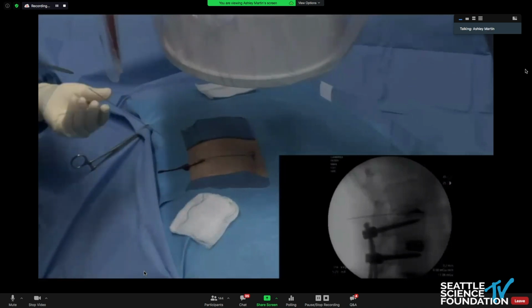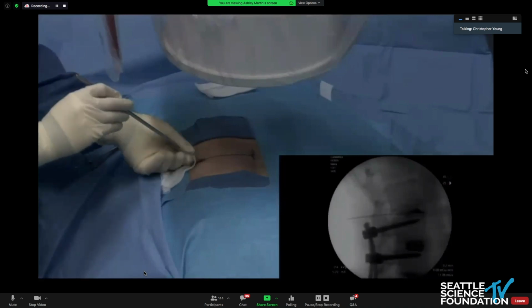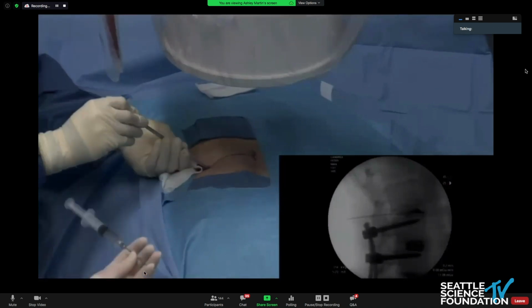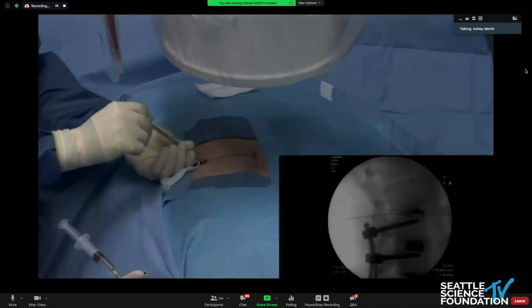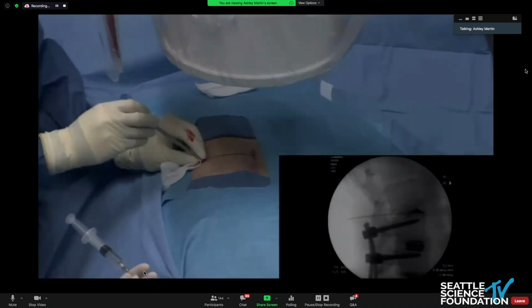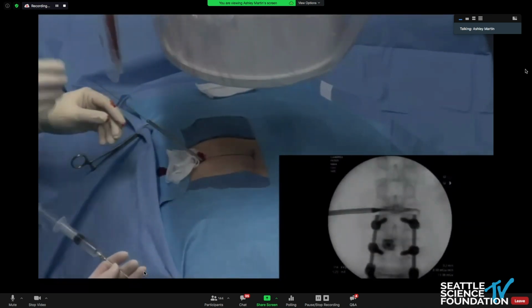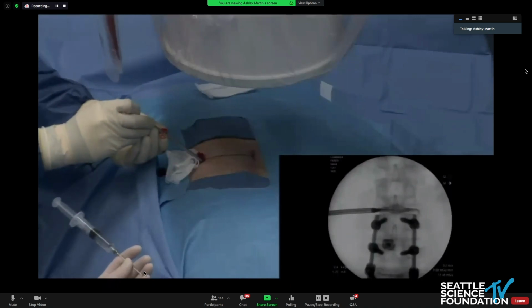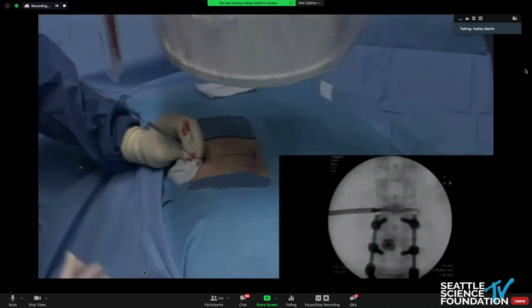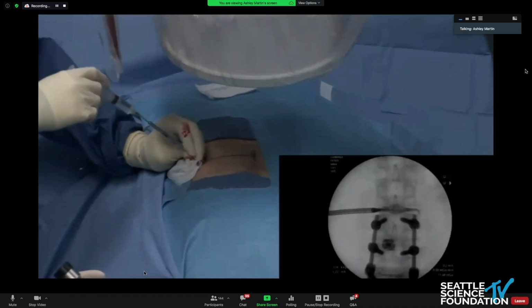We get this double obturator. Once you have that guide wire in through the needle, then you start dilating with the obturator here. And as I advance it, I'm twisting it so it goes in atraumatically, putting that right there on the annulus. Okay, that looks good. I'm also checking the needle. I'm going to back it up a little bit so we don't advance it farther. There's a second hole on this obturator where we can anesthetize the annulus. Okay, I palpate medial, caudal.